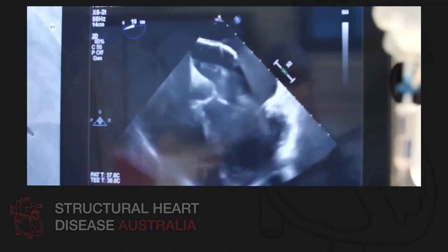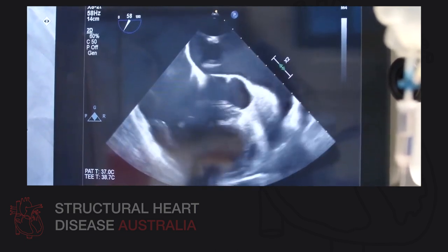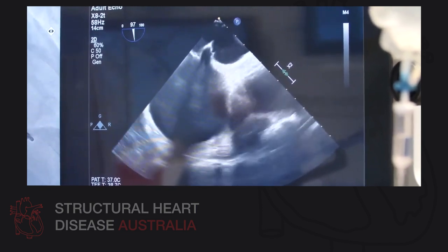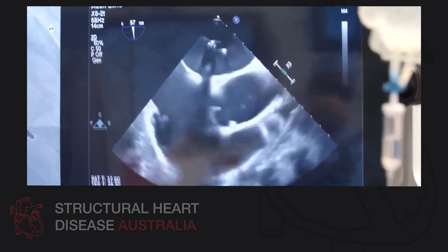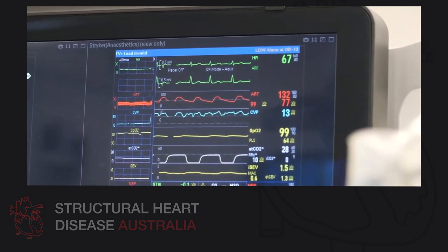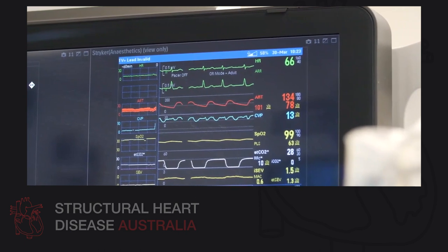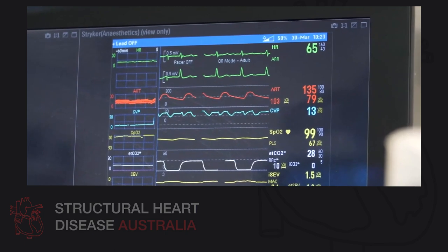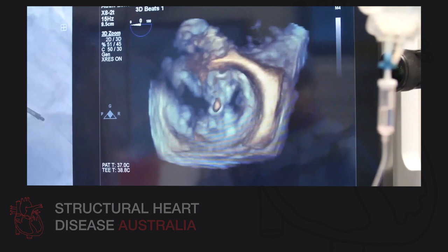Dave, have you given something for the blood pressure? Because I noticed that his systolic was sort of mid hundreds, and now it's 133. Has it gone up after grasp? Yes. So this is another interesting thing. With the reduction in the MR, we've now experienced a significant increase in the systolic blood pressure. It started around 105 millimeters of mercury, now it's 134 millimeters of mercury, and so it suggests that there has possibly been an improvement in cardiac output with reduction in the MR.